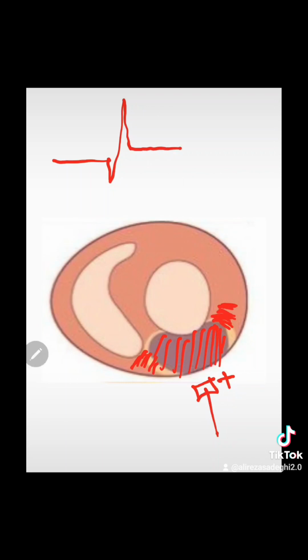Now, in the case of transmural ischemia, where the entire full thickness of the muscle is involved, the same exact premature depolarization occurs, but it can only happen away from our positive lead towards the healthy cells. And because this occurs away from a positive lead, what ends up happening is that the beginning of the QRS complex is actually depressed. The rest of the QRS happens, and the ST segment goes back to where it originally should have been. And so what happens is that on your ECG tracing, this will give you the appearance of ST segment elevation.